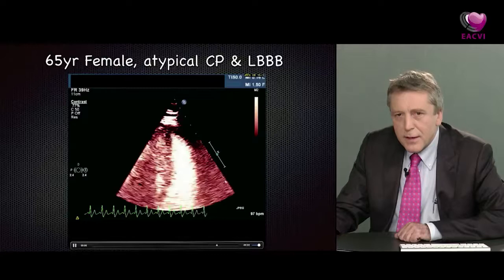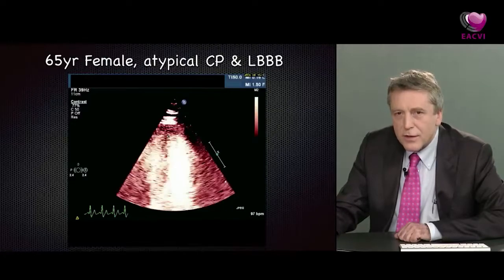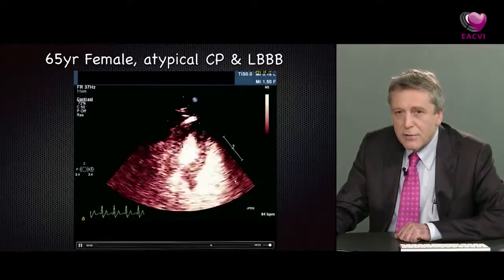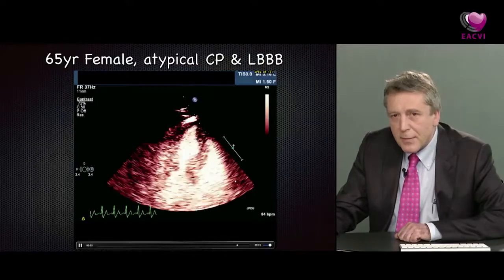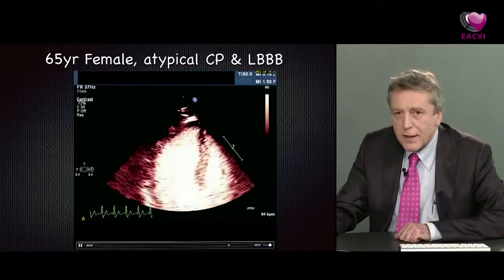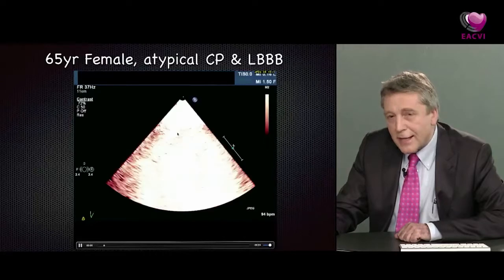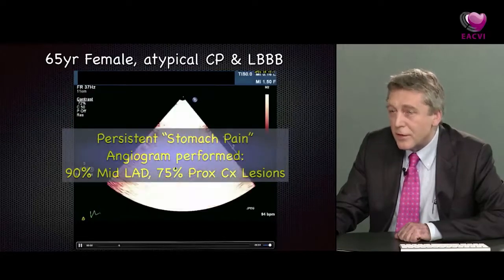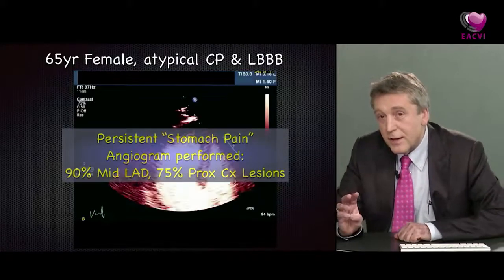And then here's the 3-chamber view, which is, I think, quite nice, because it shows both before but particularly after the flash, really delayed reperfusion around the apex into the anteroseptum and into a good deal of the posterior wall near the apex there. So in fact, when this patient was angioed, they had important disease in the LAD and reasonably moderate disease in the proximal circumflex, which actually fitted with the MCE images rather than the wall motion.